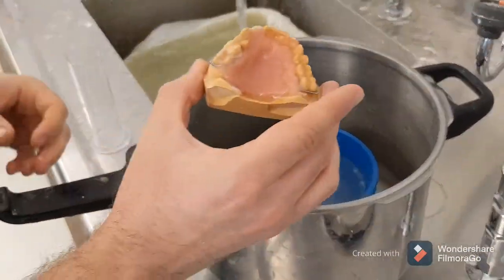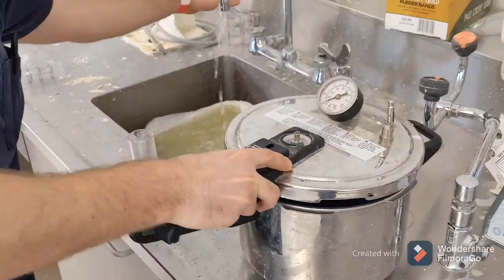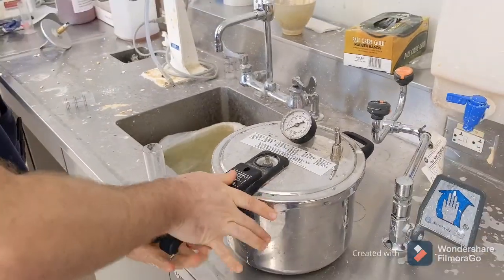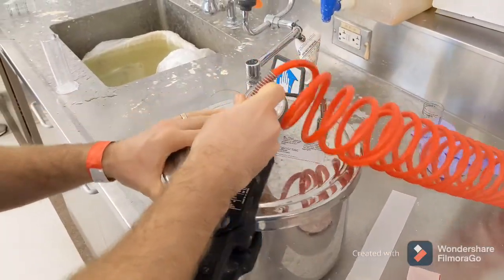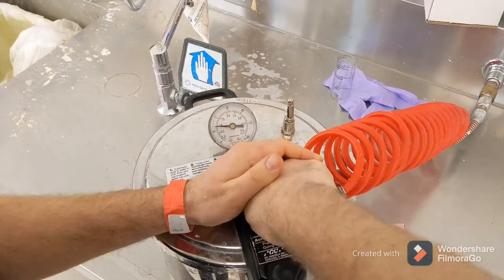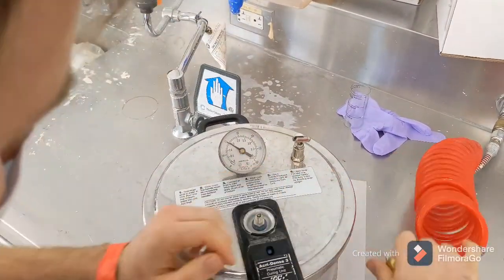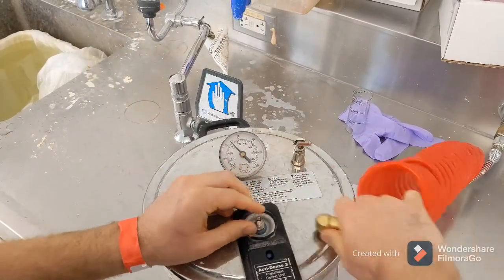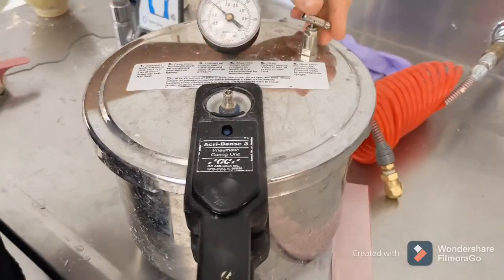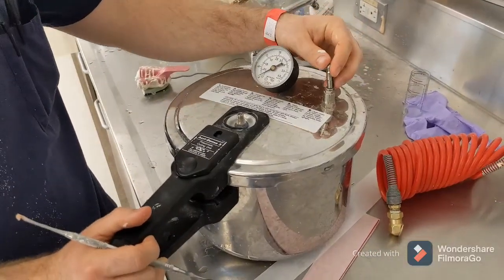We're going to submerge it in warm water. We want 20 PSI. We've got 15 minutes at 20 PSI. We've got the pressure set.